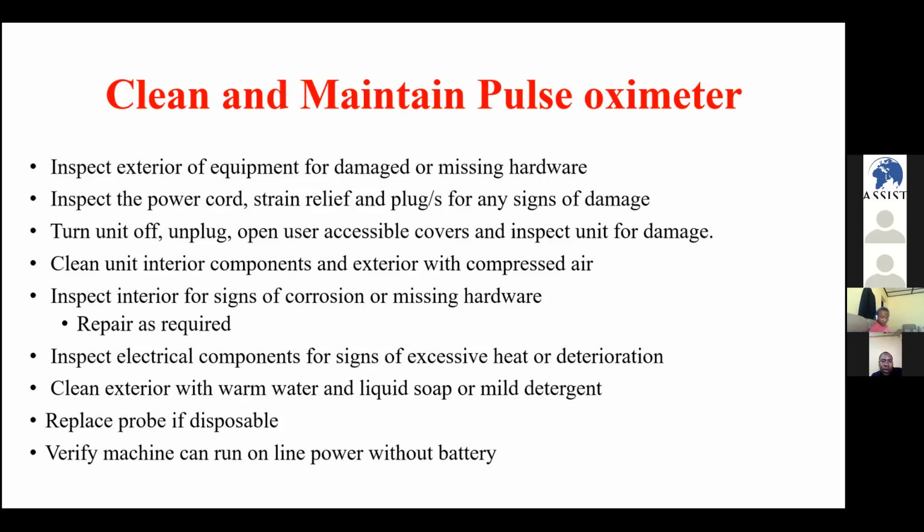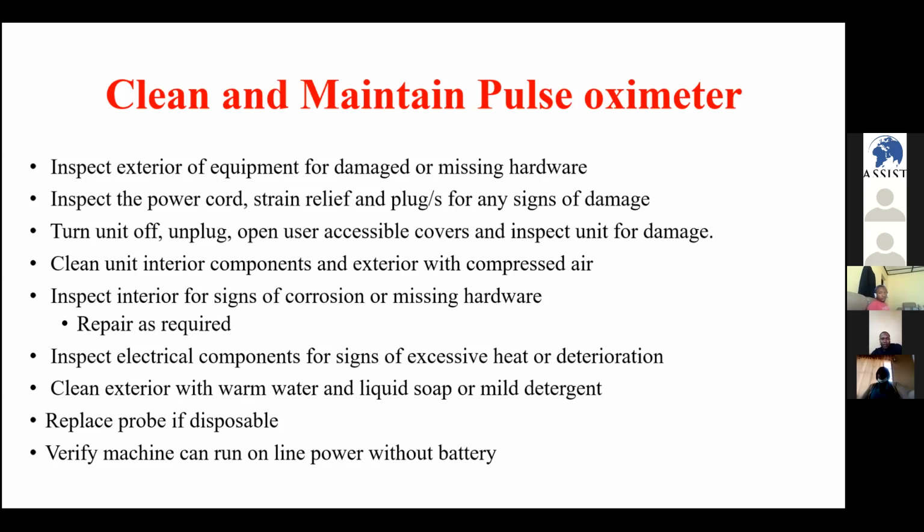You also have to inspect the electrical components for signs of excessive heat or deterioration. If the probes are disposable, you can replace them, and verify if the machine can run on line power without the batteries. So you plug them in and see if they can function without inserting the batteries.